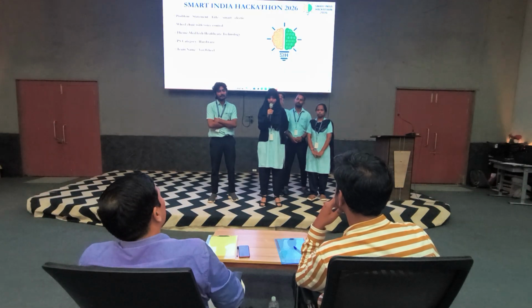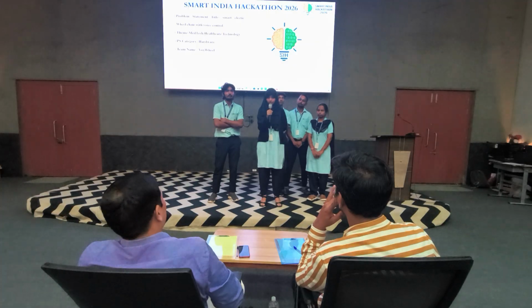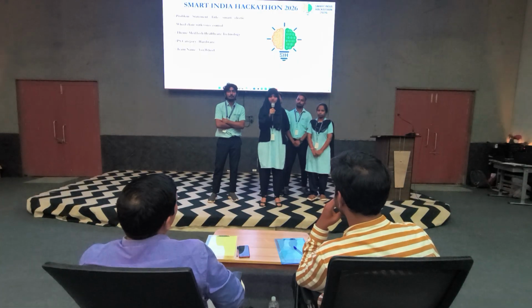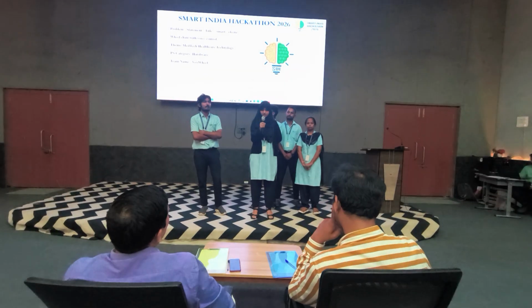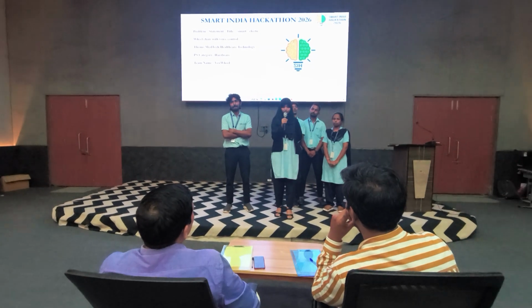At present, there are projects on that wheelchair, but they need someone to guide or a helper who needs to work on it. Joystick is there, voice control is also there, but it is not more workable or more free. Our main agenda is to give patients freedom independently. They only have to work on it.